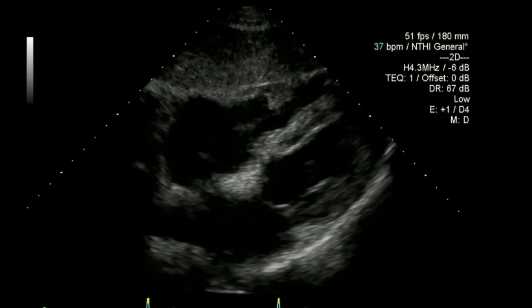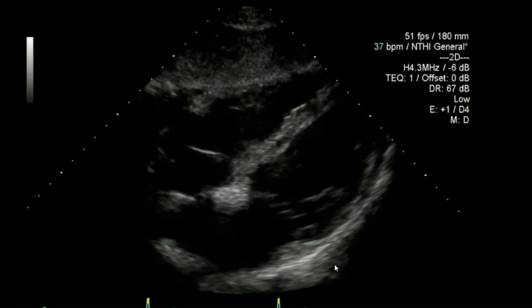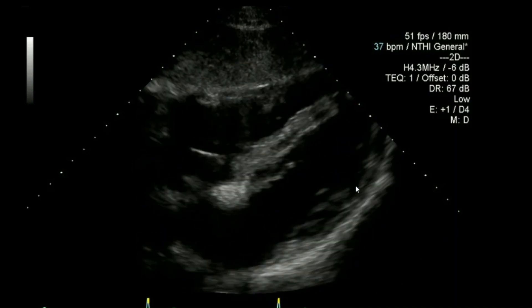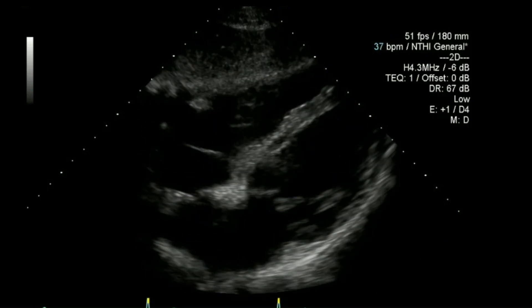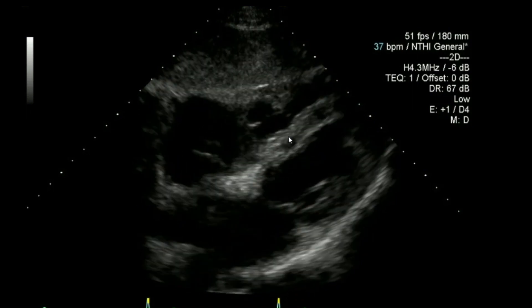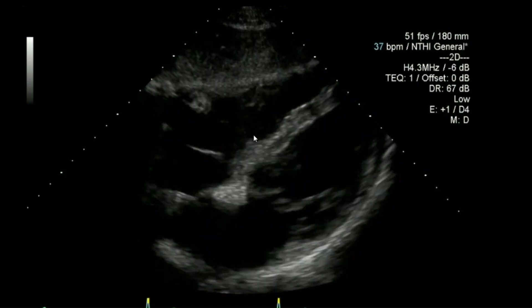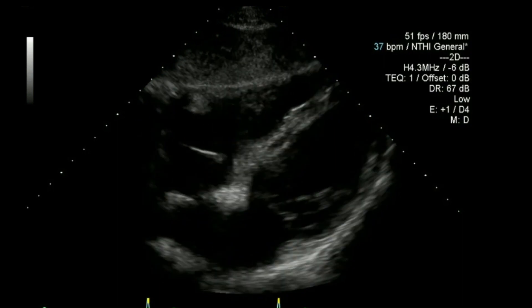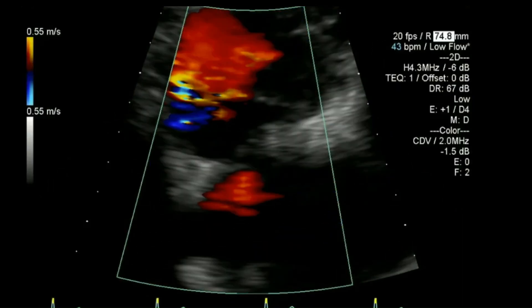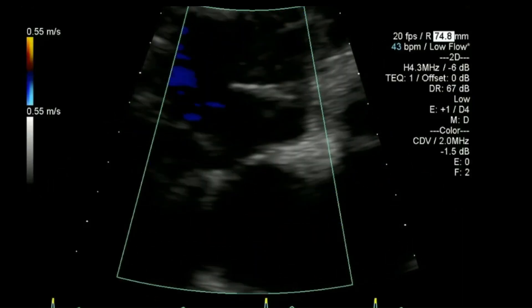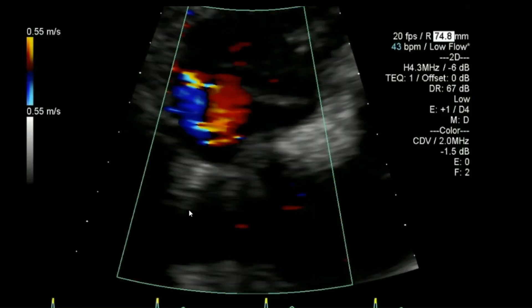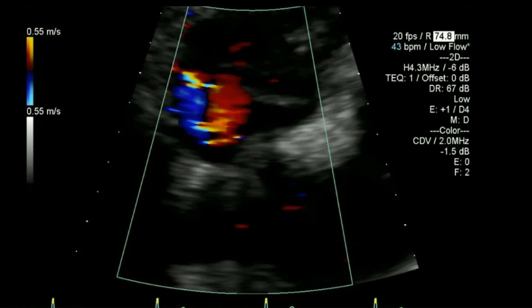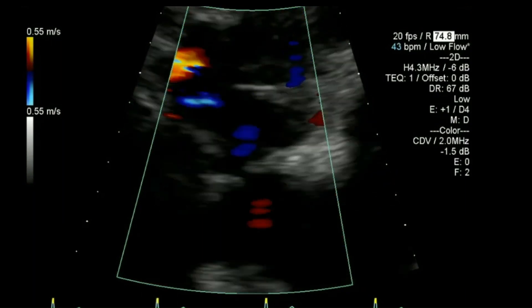Now I've gone to a subcostal four chamber view — again one to two centimetres behind the heart, full width to try and see everything. If needed I'll zoom on the right ventricle or any other structures as required. Normally I'll come up and have a look at the atrial septum to maximise visibility of any PFO or possible ASD.